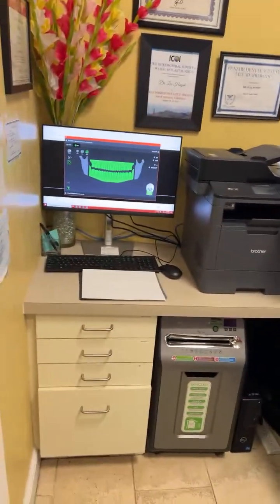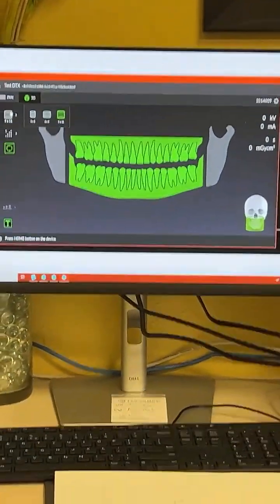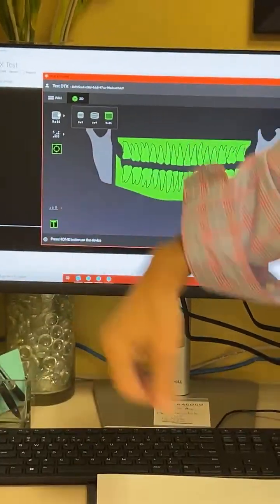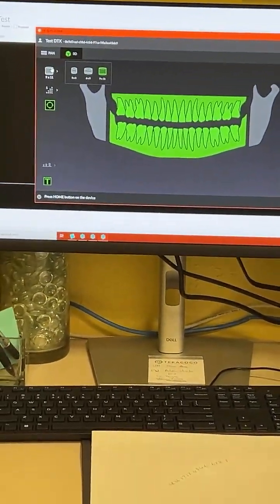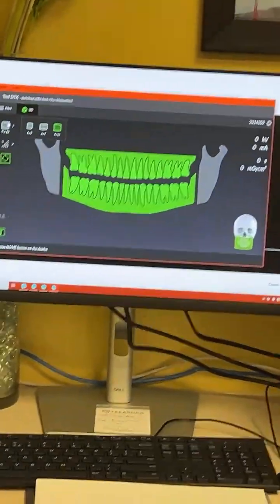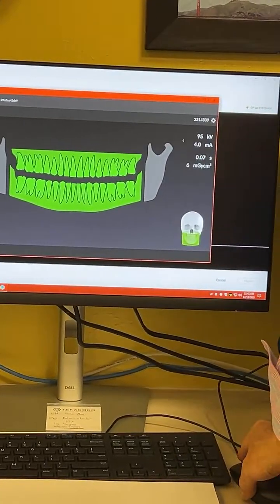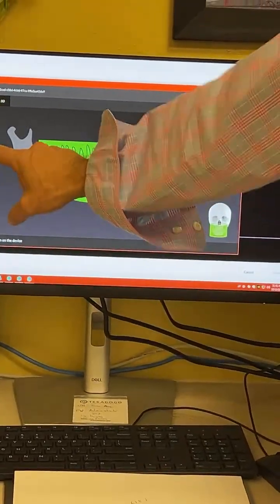Okay, so the first one to go for, is that a T4? No, don't worry about that yet. Right now, I'm just telling you about the scout. That's on by default. I encourage you to use it. It's up to you. So Larry, how do you use the scout again? You just press that? I'm going to take this off. Okay, so that's there.